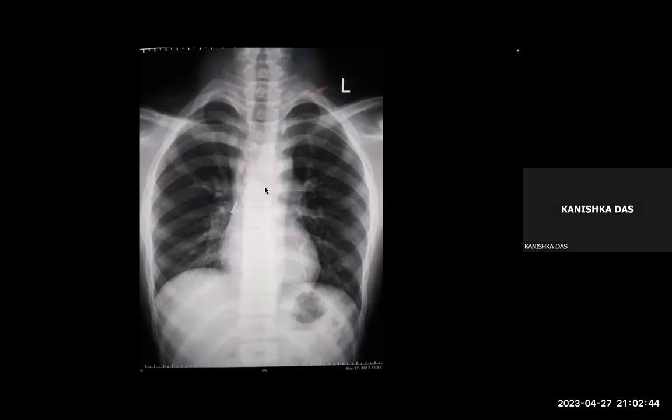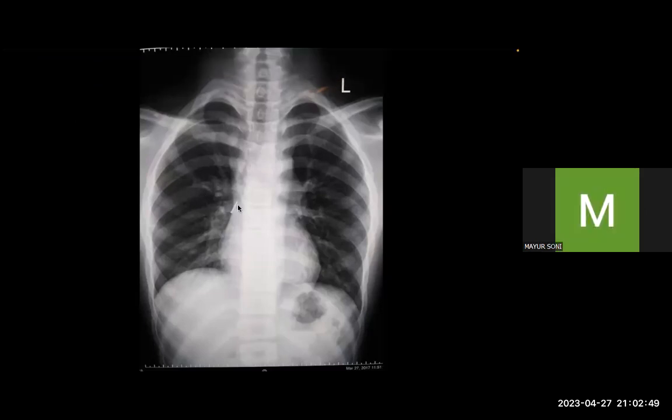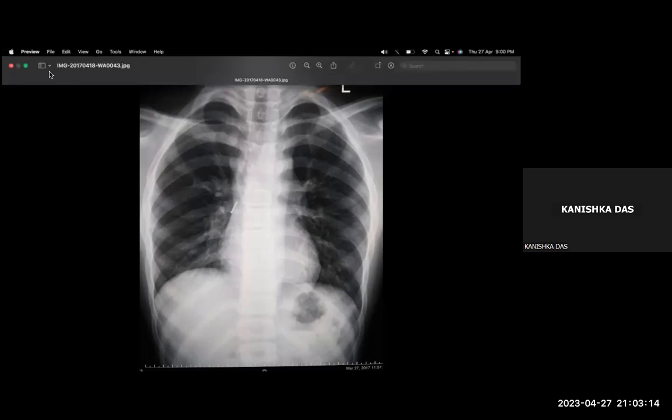You have different forceps that you use? Yes, sir. So what forceps are you going to use for this, or any hard foreign body which you have to grasp? I will use a metallic tooth grasper. Okay, you have an alligator, no? Yes, sir. Optical alligator forceps. So that's the type of thing you use for this, not the usual peanut forceps.